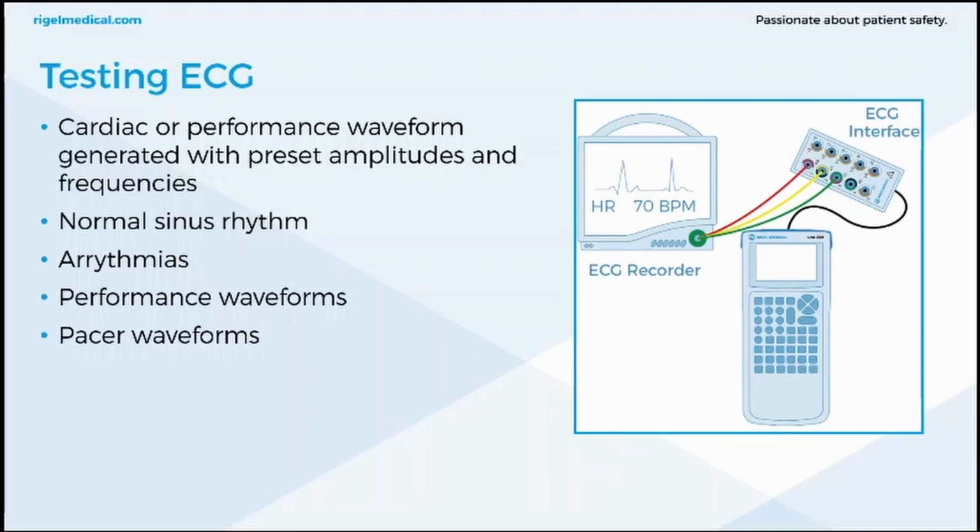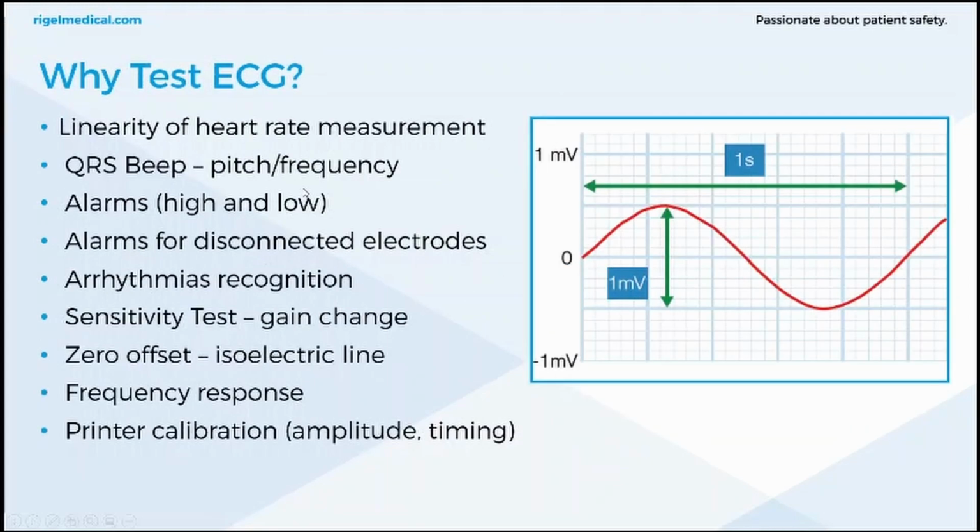Normal sinus rhythm, arrhythmias, performance waveforms, pacer waveforms. So to test ECG, we're simulating multiple arrhythmias, just electrical signals. Basically, from an electronics point of view, it's a signal generator. Testing ECG, it's an accurate signal generator that replicates all the different waveforms.